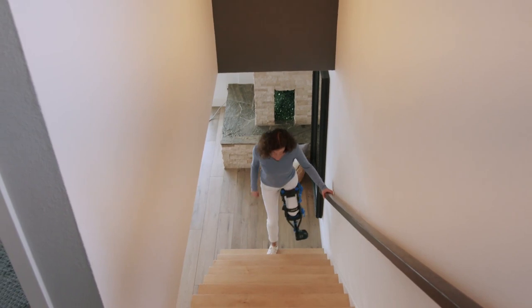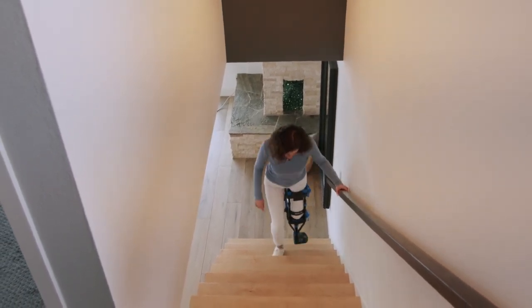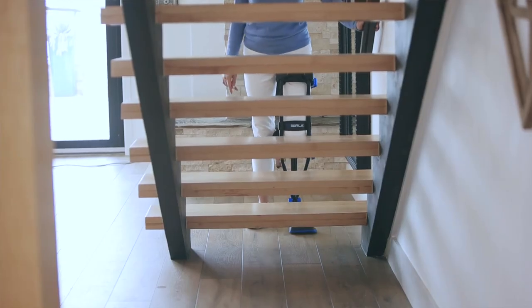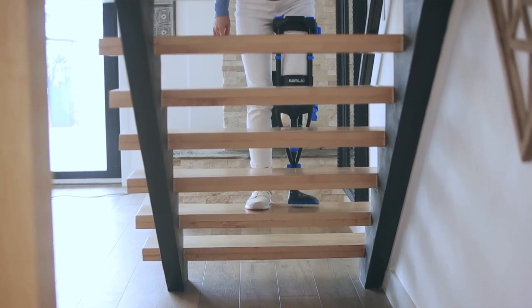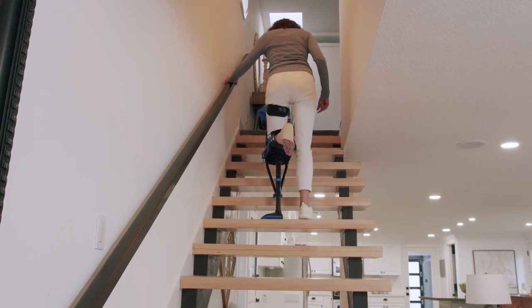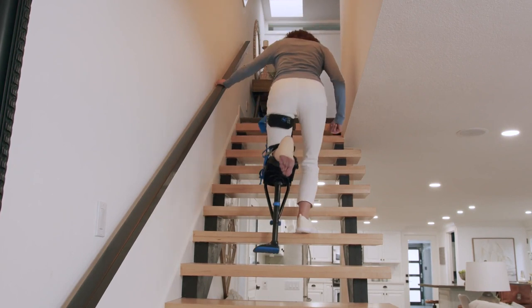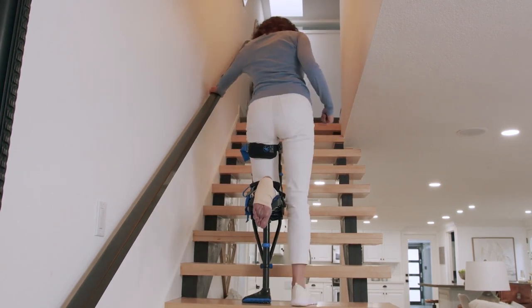One of the best things about the iWALK is that it allows you to use the stairs safely. When ascending or descending stairs, always use the handrail. To go up, start with your good leg, followed by the iWALK leg, going one step at a time. The recommended way to descend the stairs is to go down backwards. Start with your iWALK leg, followed by your good leg, and continue to descend one step at a time.